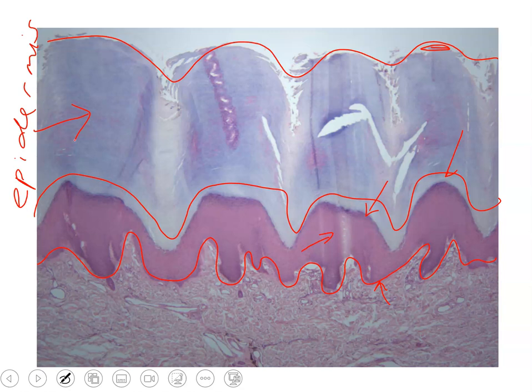So the epidermis is made up of a specific tissue. If you see a slide and it's asking you to identify the tissue in the field of view, this is a keratinized stratified squamous epithelium. Specifically, we find this slide. This is the slide showing you thick skin. The thin skin slide, most likely the scalp, will not have that stratum lucidum because stratum lucidum is only found in thick skin.